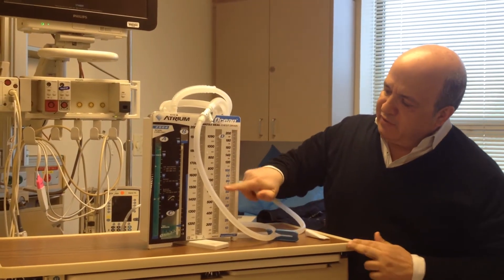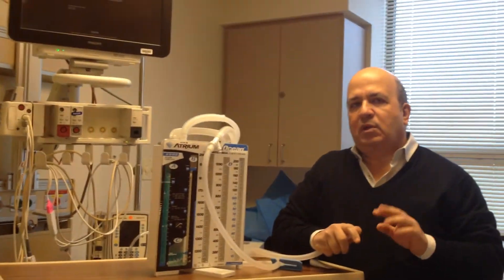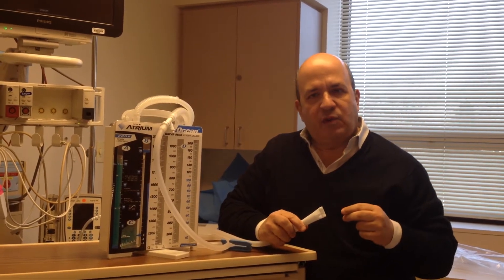So the drain here — you obviously keep track of your level. When we order someone's chest tube to come out, what we do is we have the patient on suction for a couple of days. Then when we're ready to take the chest tube out, we convert them to water seal.